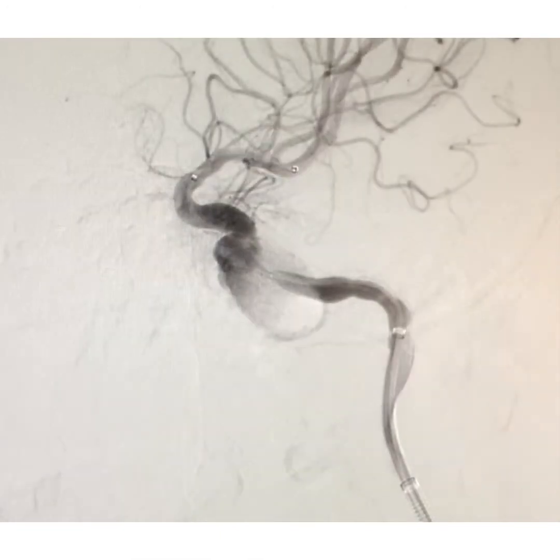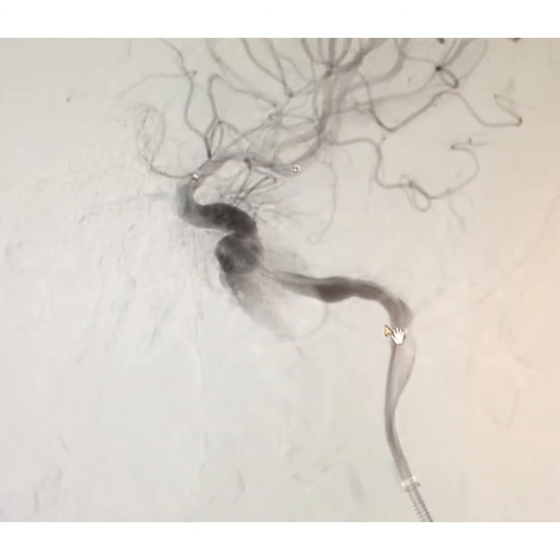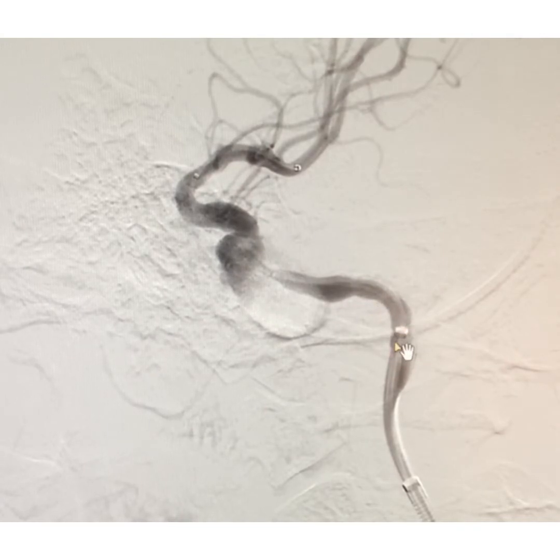Whenever we want to do a flow diversion, basically we need to take a good 7F long sheath over here, and then we take a distal access catheter. It could be a Navien, it could be a DAC, and once we cross enough distance, then we take the microcatheter and wire and try to cross and place the microcatheter distal. Here we have taken a Headway 27, which we have kept in the middle cerebral artery M1, M2. And once we have this beautiful access, you can navigate the flow diverter easier. Otherwise you can have challenges.